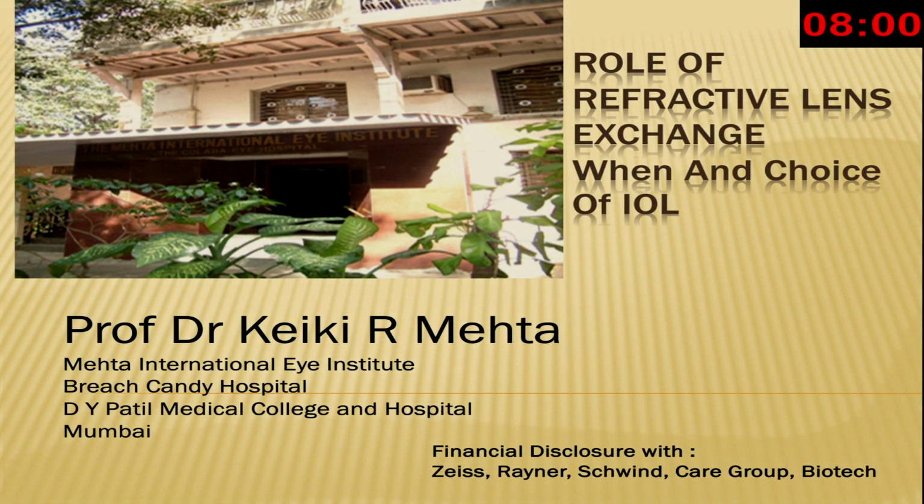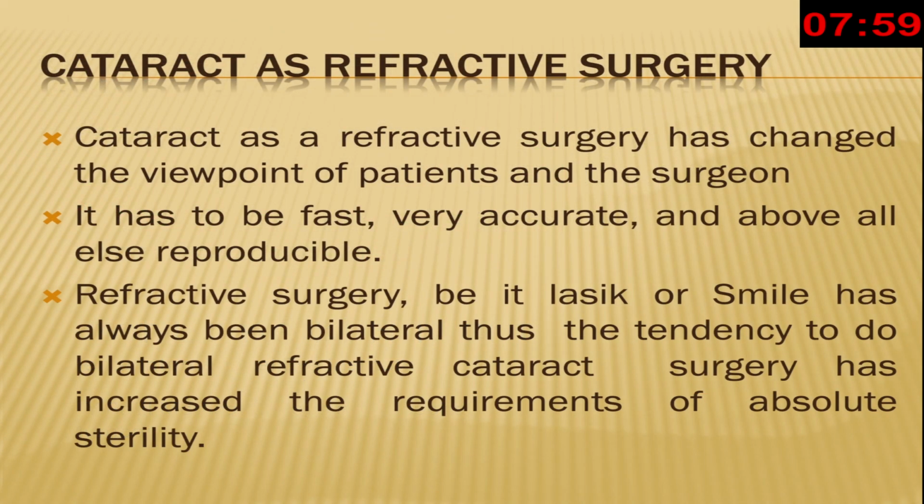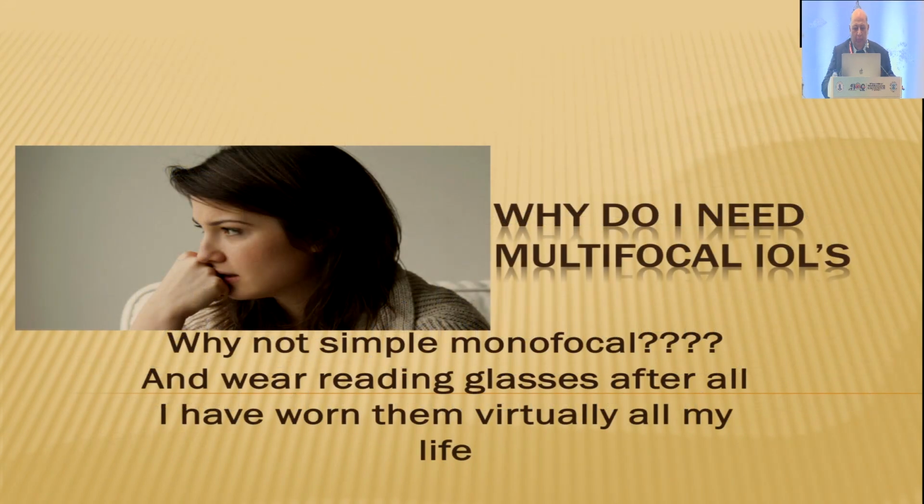Thank you very much for all those very kind comments. As we are now aware, cataract is a refractive surgery. From the viewpoint of the patient, the advantages are that it is fast and reproducible. Be it LASIK or SMILE, refractive surgery is bilateral, and thus the tendency now is to do cataract surgery also in a bilateral mode. I'm not going to dwell too much on the technical side of it, because everybody is well aware of that. I'm going to dwell on topics which are a little off the line.